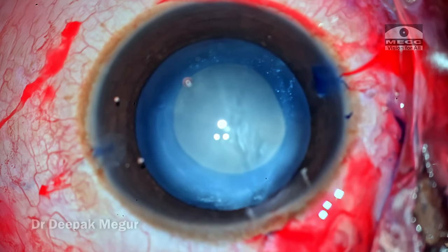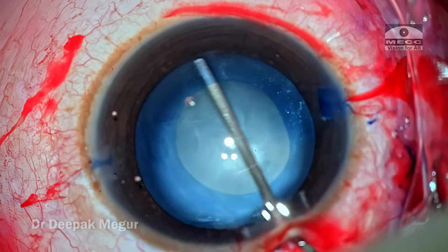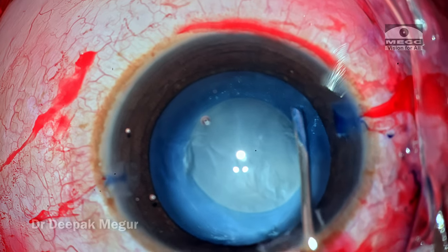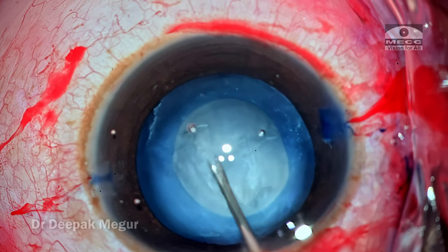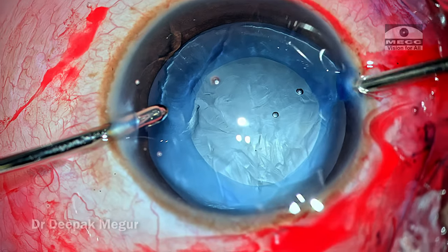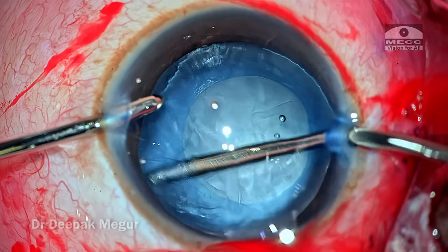The rhexis turned out to be pretty good. I am trying to separate the lens matter from the anterior capsule and injecting a little bit of fluid under it to confirm the lens matter is free. In this six-year-old boy, I expect the lens matter to be very soft, so I am going in with bi-manual irrigation and aspiration to aspirate the soft lens matter.